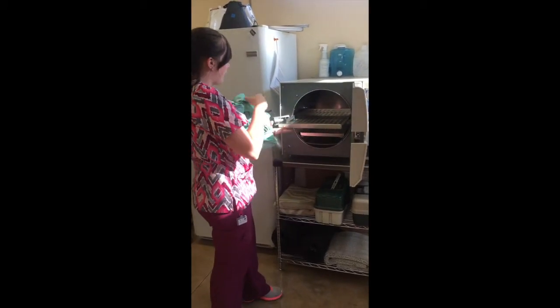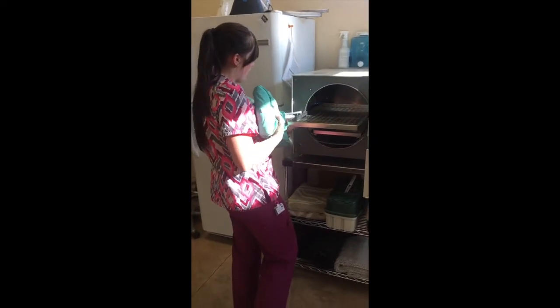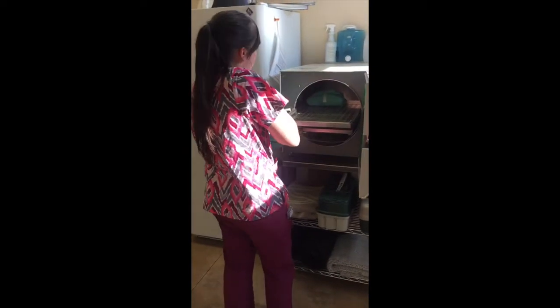So I'm going to go ahead and pull the tray out. So when I put my packs in here, I want to make sure there's at least 3 centimeters in between the packs. So I'm going to go ahead and put those in there.